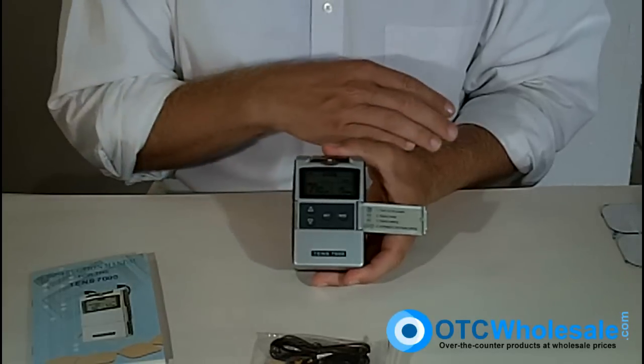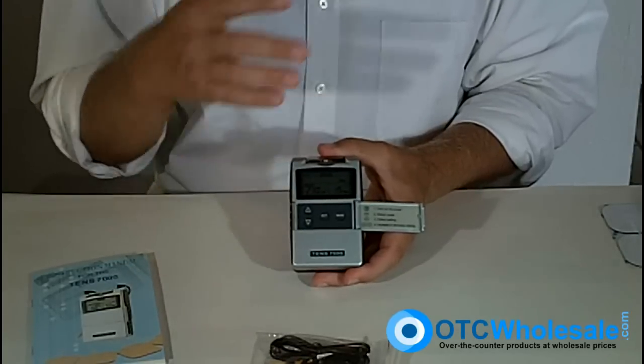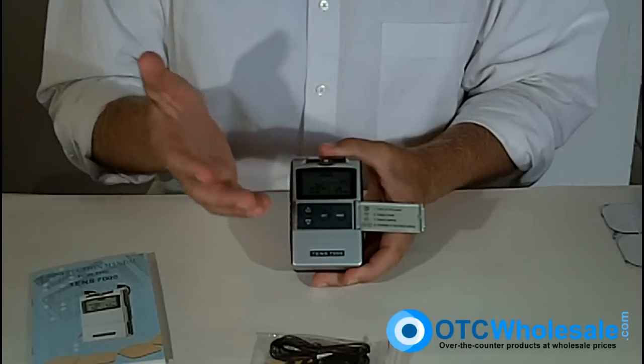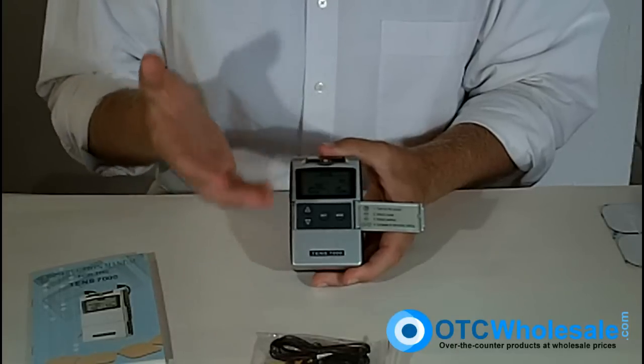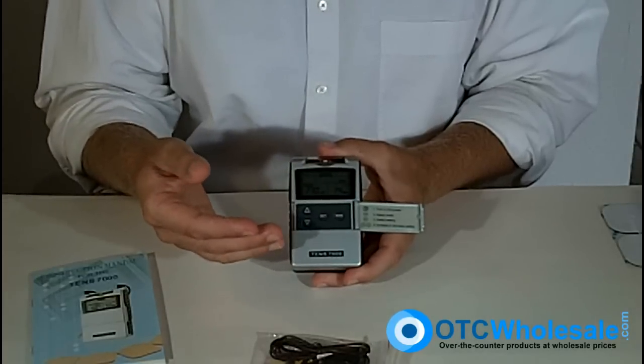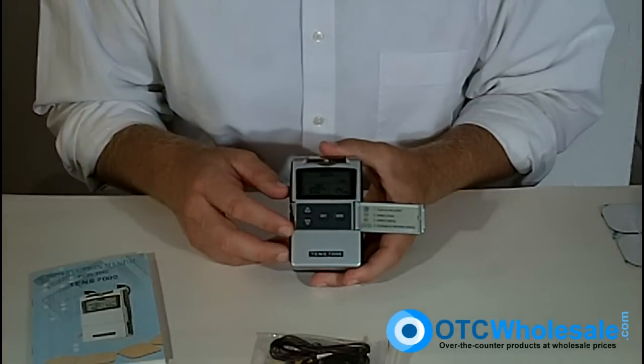That's important because for different types of pain and different parts of the body, you'll want to use a different mode, rate, and width. Also, your body can adapt to the particular wave that you've been using, so a small adjustment can make a big difference in pain mitigation. You should work with your practitioner on that.